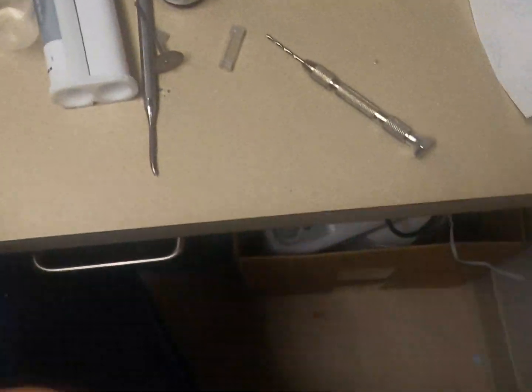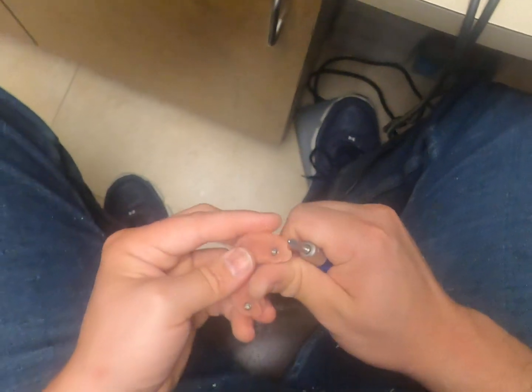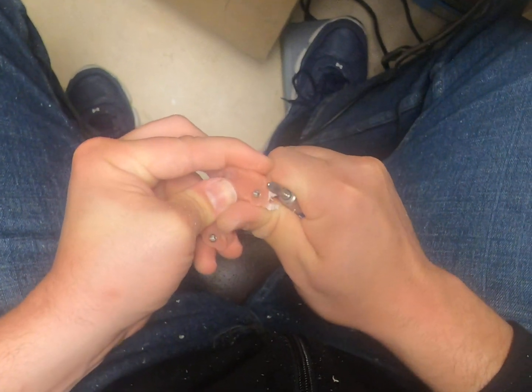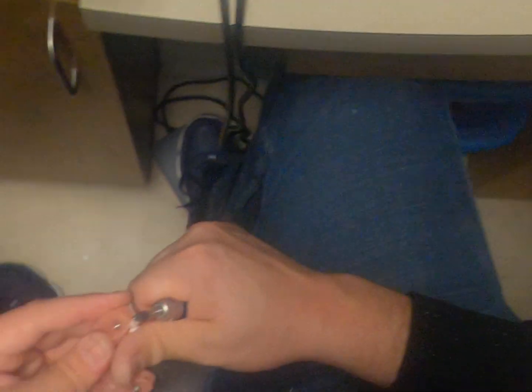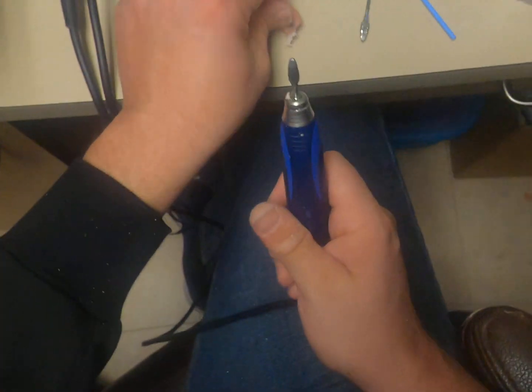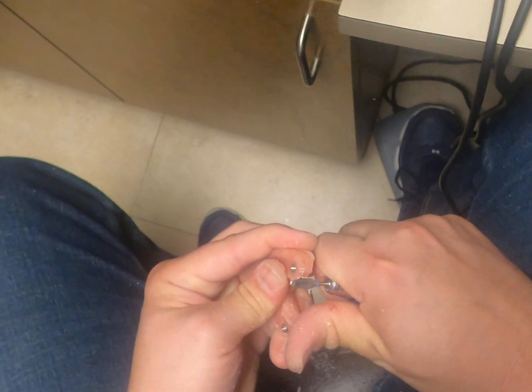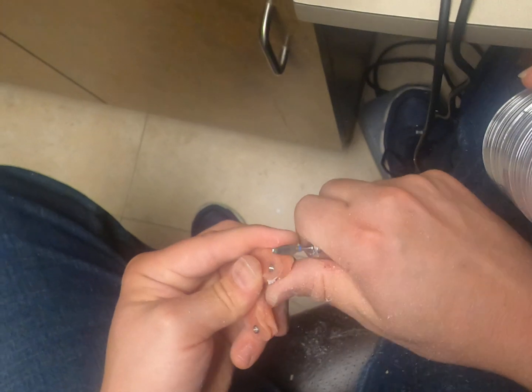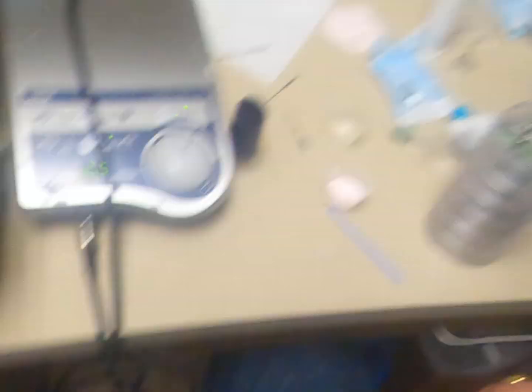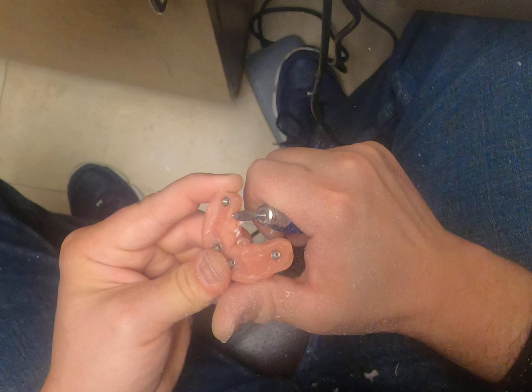This is going to take a while because this burr is dull — can you grab me a better one? Yeah, let's use the green one. The biggest thing is you select from the front end, because somebody might not want to come back. We have them pay up front — the whole thing, including the final. So you're okay with the provisional covering everything? I'm pretty great with it. Low clears too? Yeah, we're going to make it work.